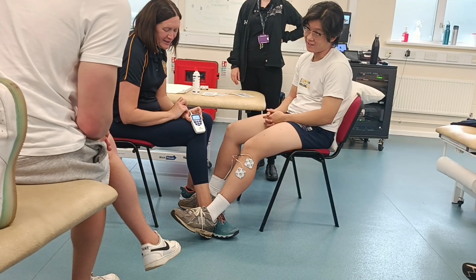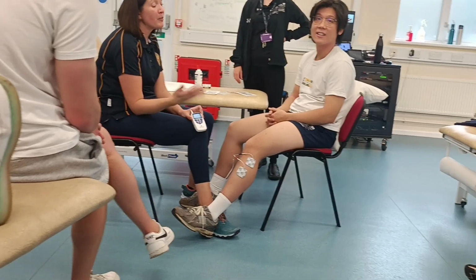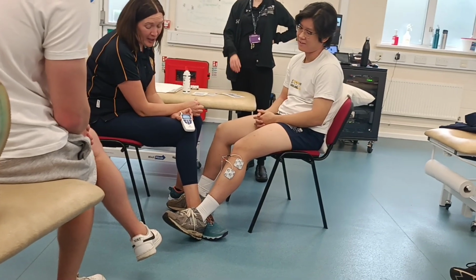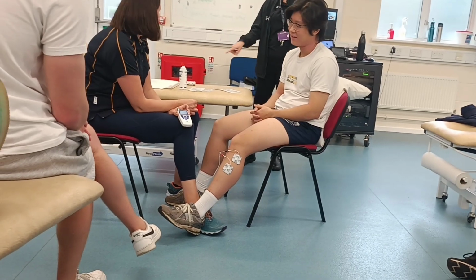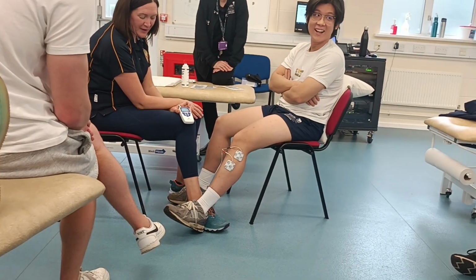And then when I was assessing my patient, I do perhaps a good 10 contractions, check that it probably will fatigue a little bit, so I probably will need to turn the intensity up as my patient accommodates and gets used to it. But then I can't get used to the very quick ramp on it. I did end up playing with the ramp because you can play with it, but it's very arduous to do the ramp on this. There we go. That's the movement that we're after.